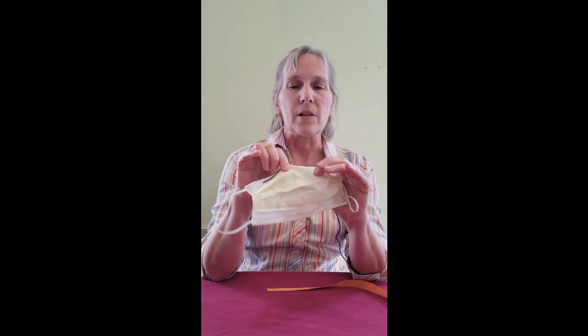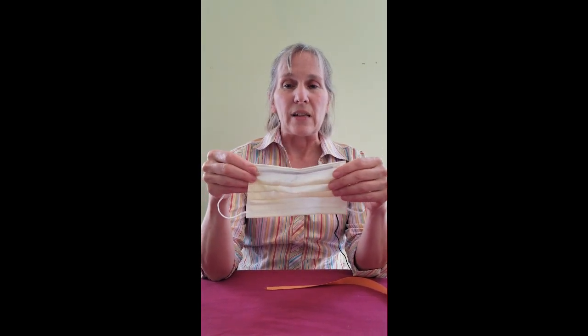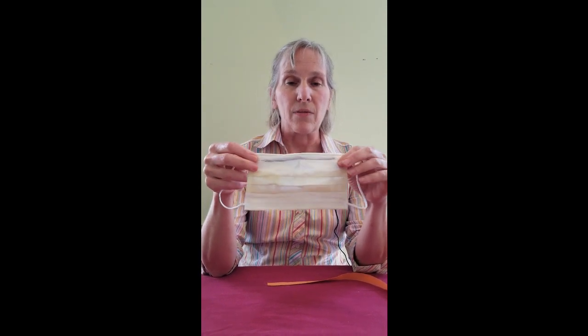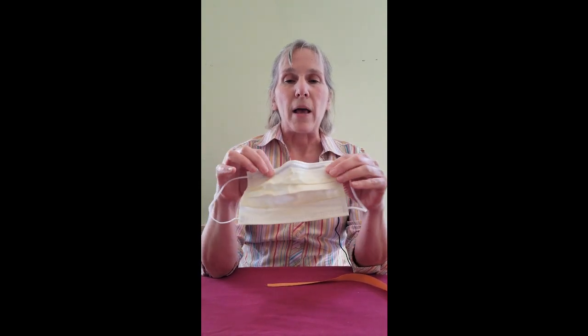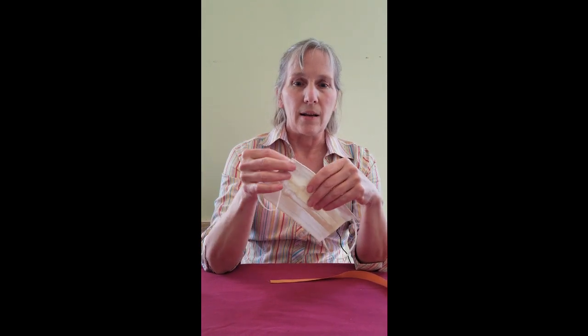The real difficult part, the thing that helps make any mask effective, is having a metal nose piece to help form a better seal around your nose. Now, surgical masks, this is polypropylene. If you could see this up close, this is a very lightweight layer of polypropylene. Since it's what's commonly used in surgical masks, I tend to believe what I've read, that the polypropylene does have good effectiveness. In this mask, which also has the metal nose piece, I just cut it open and pulled it out to see what's in there, and it's basically just a twist tie.